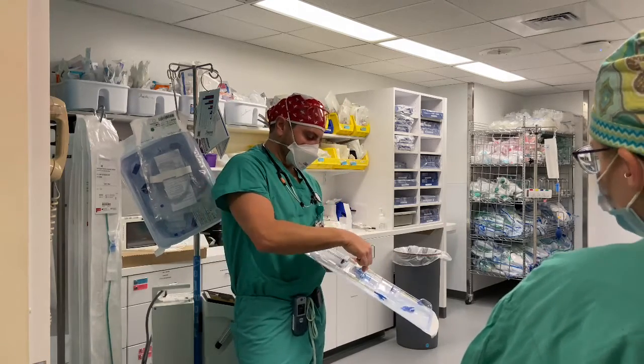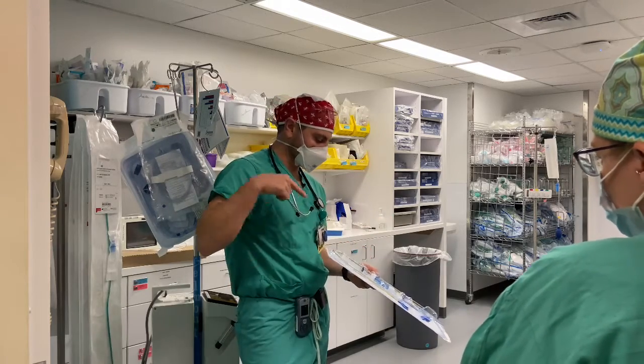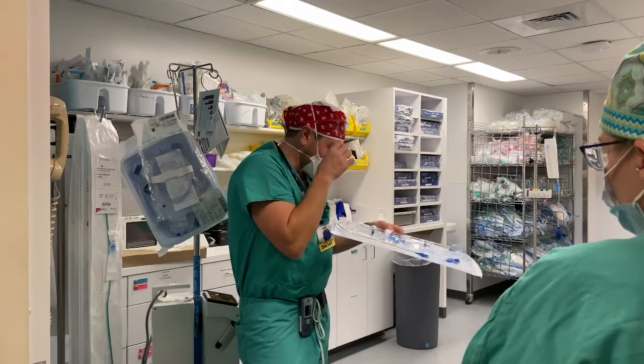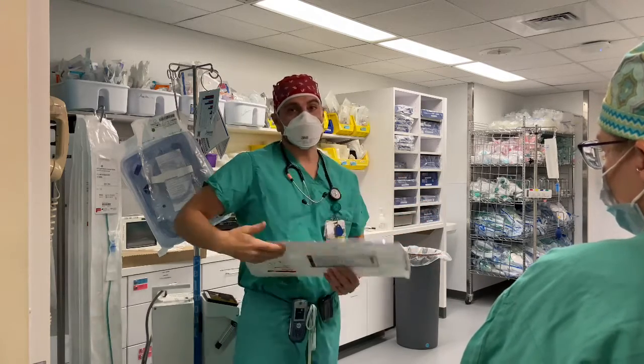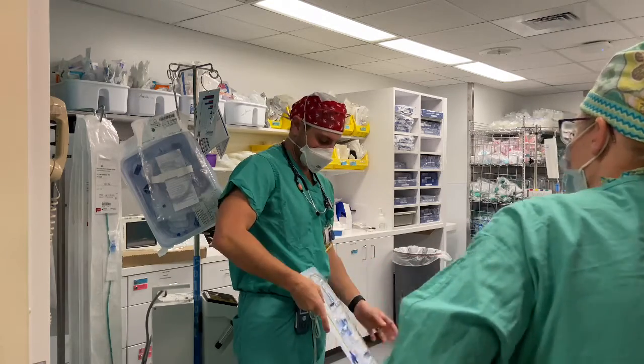So you'll see people connect this to a patient and be ventilating them with this connector, and then try to thread the scope in, thread the bronchial blocker down, and do it all looking at the camera. Try to just drive the scope down through this little circle. Much easier, and you guys can even give them this tip if you're watching somebody really struggle like that.